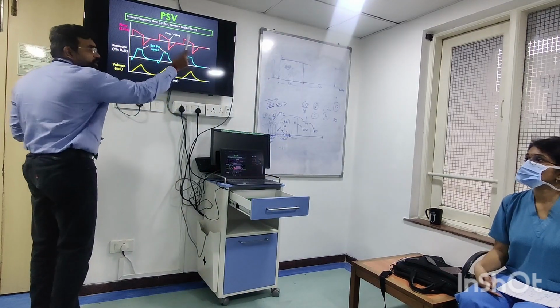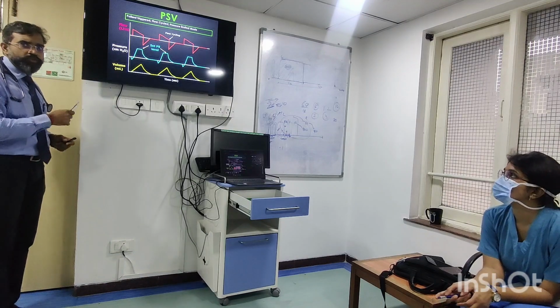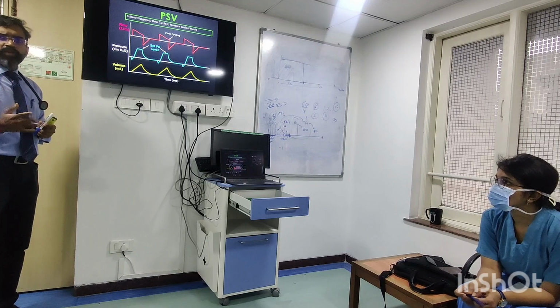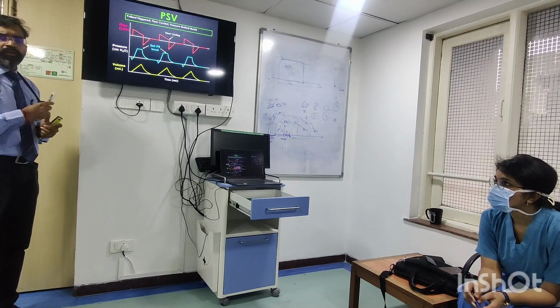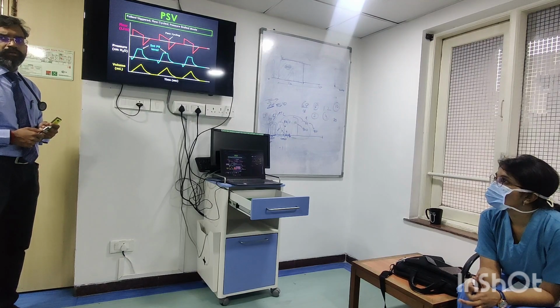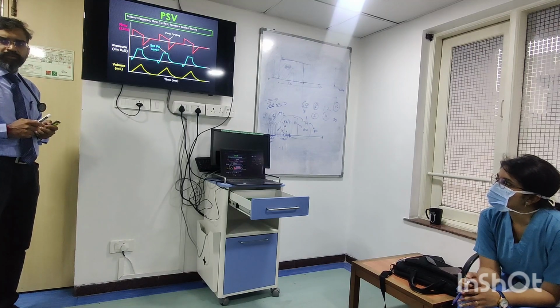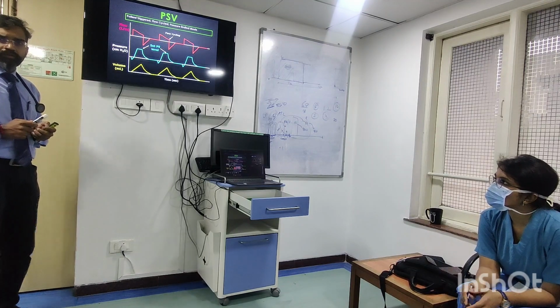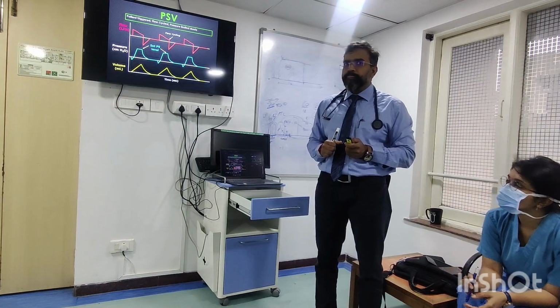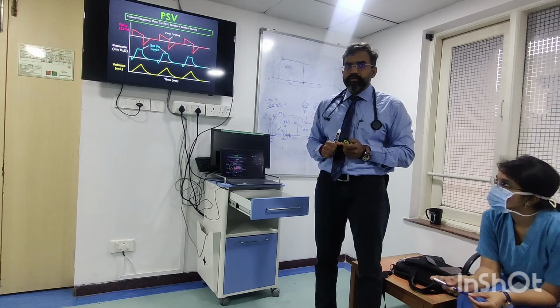This is all what kind of breaths? Sachin, can you tell me what kind of mode this is? When I say what kind of mode, immediately you start talking about trigger, limit, cycle, variable. Yes, tell. There is a patient trigger. Why is it patient triggered? Sir, since there is an initiation of breath from the patient side. Very good. And it is limited by pressure. Very good. And cycled by flow.